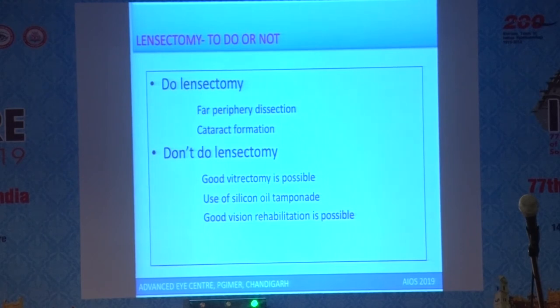And the role of lensectomy, because in most of these patients you will require oil. So lensectomy for peripheral dissection, whether to do it or not, you have to actually take a call.